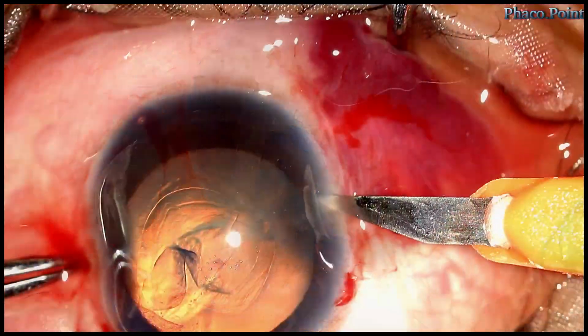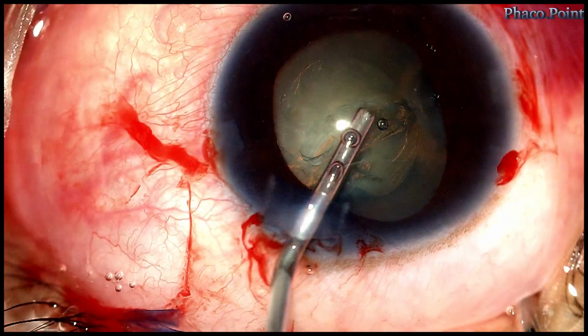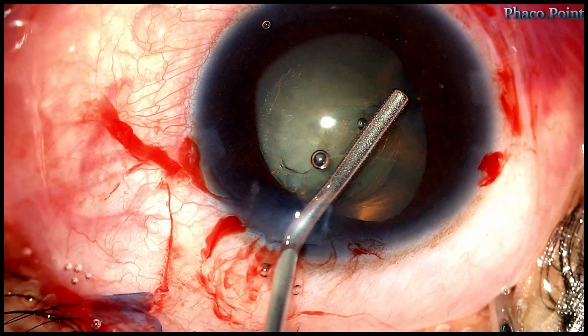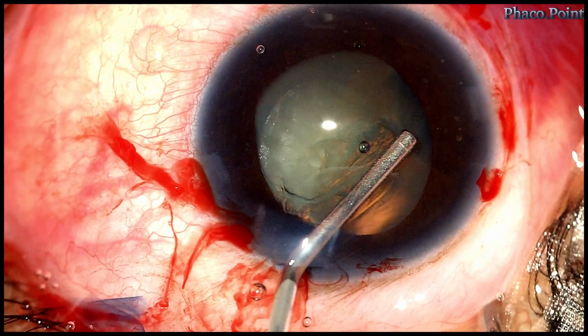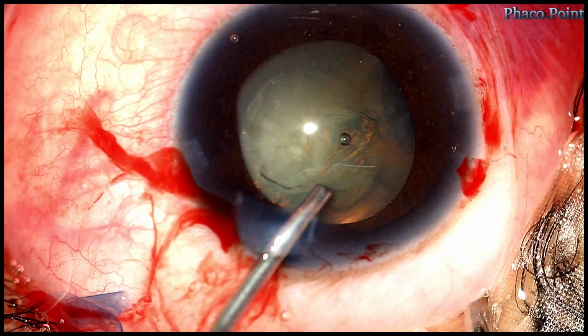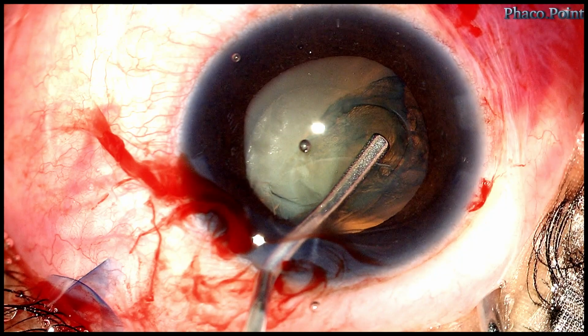I now make a third paracentesis incision in the area of the zonular dialysis to be able to support the capsular edge with a capsular hook in this particular case. I intermittently inject some dispersive viscoelastic over the area of the zonular dialysis. Next, I inject the dispersive viscoelastic under the capsular rhexis edge at the proposed site of holding the hook or the introduction of the CTR.